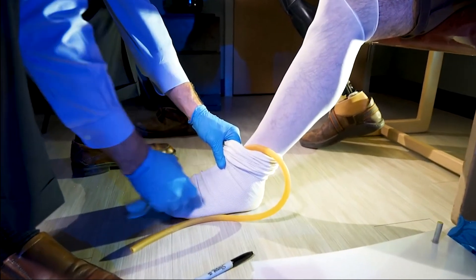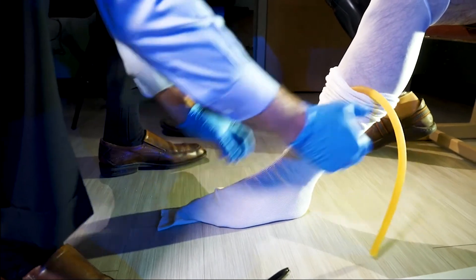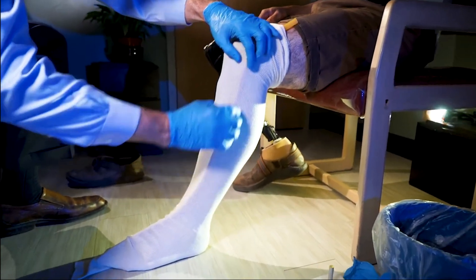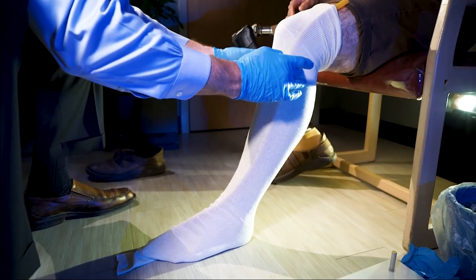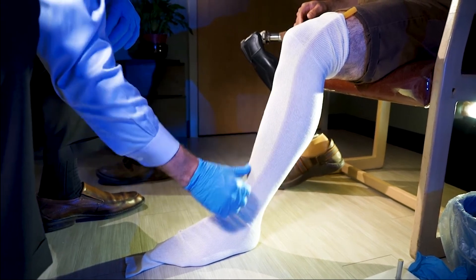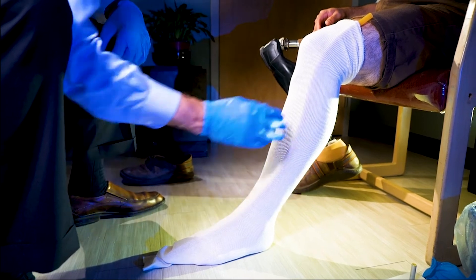Is there any special consideration you make when placing the cutting strip? The cutting strip should be placed down the center of the foot and halfway up the shin. We want to cross to the lateral side. I want the cutting strip to be located between the fibular head and the tibial tubercle so that I have good access to both these bony prominences. This will allow me to have the best access and the best casting shape over the anterior tibia. If I'm not able to see the tibial crest, I'm not able to create the proper relief within the brace.